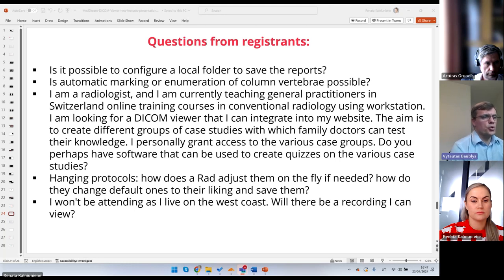But I can assure you that MedDream could be a big part of the solution you're describing, because many companies which do healthcare trainings and quality checks are using our product in the US and in Europe. I know of more than one company which actually created learning systems using MedDream and their own applications.